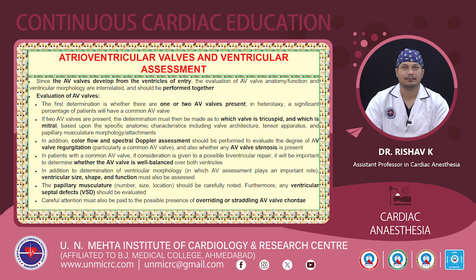Now coming to the next segment of the heart, that is the atrioventricular valves and the ventricular assessment. Since the atrioventricular valves develop from the ventricle's entry, therefore the evaluation of AV valve anatomy and function and the ventricular morphology are interrelated and should be performed together. Here we have to know the presence of concordance or discordance. So the basic principle here is that the atrioventricular valves are related to the ventricles into which they empty.